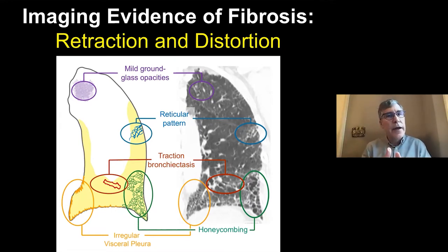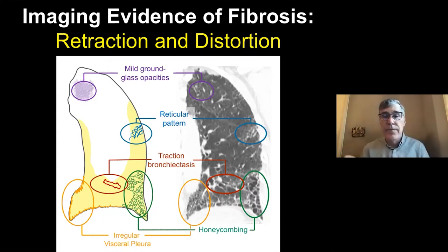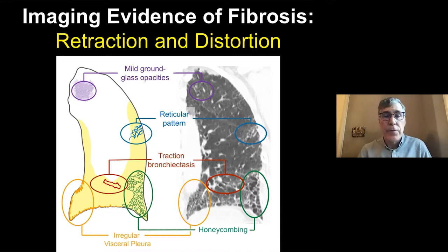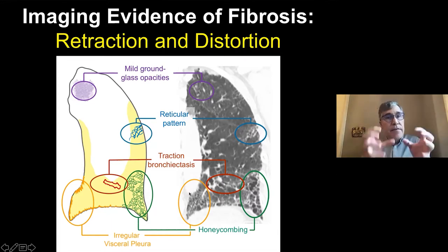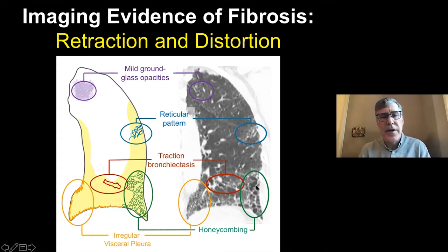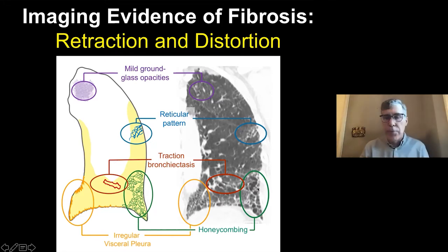Nothing is wrong with the airway itself — it just lives in a bad neighborhood, secondary to that retraction. Irregular visceral pleura is very helpful: the pleura should be nice and smooth, but when it looks spiculated, that's a sign of retraction. Last is honeycombing — one of the most important and very difficult findings. These are small cysts right up against the pleura.